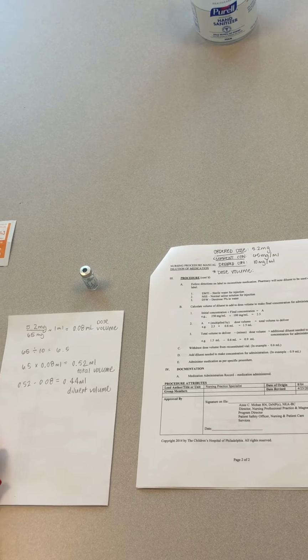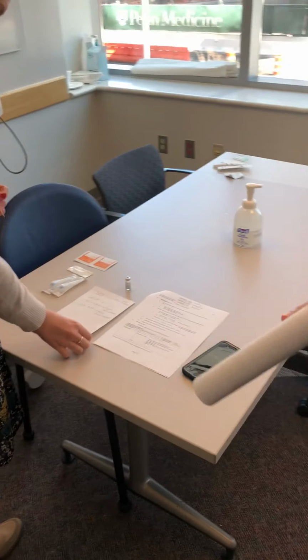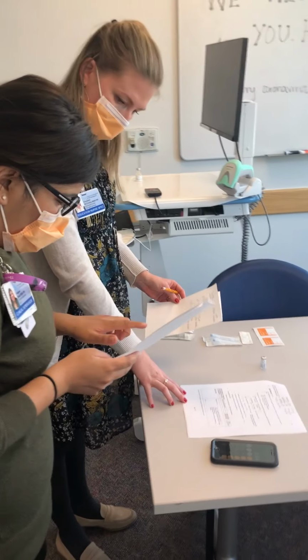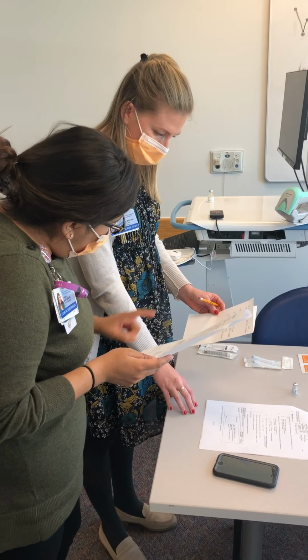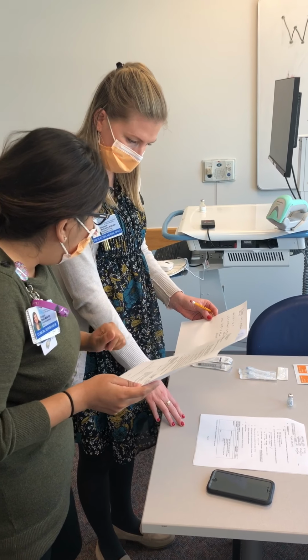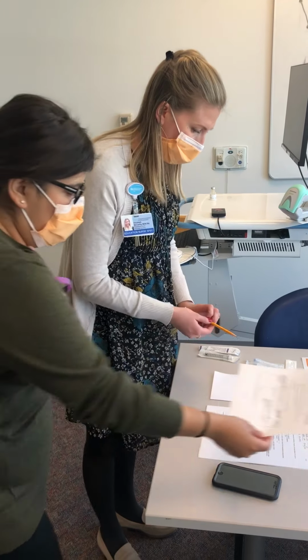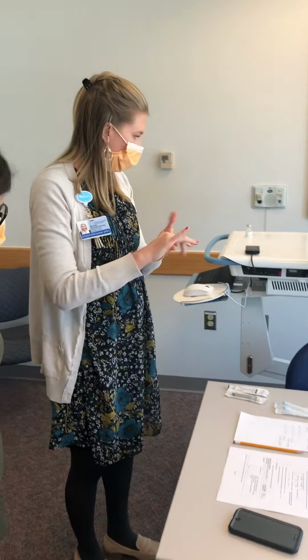So let's see if Val got her same answers for the med math. All right, let me just double check the math that I got was the same. Okay. So I got the same amount for the dose volume, which is great. Same amount for the total volume to give, which is great. And the same amount of volume of the diluent to give. Okay, so I will just ask you to hang around while I pull it up and just eyeball it and make sure. Sure. Before I get it.